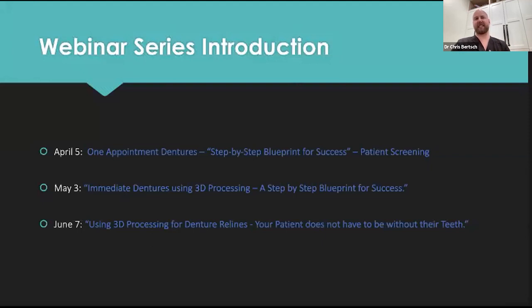And I always like to include photographs because, like I said, I started a couple months ago, and the results are just, the dentures just fit the patient and fit their face. I think it's just because the lab has a reference point. So I honestly encourage always including photos for complete dentures. Partials less, but for completes, yeah.